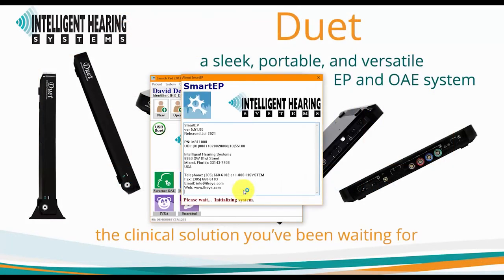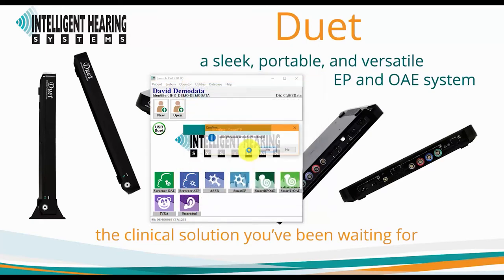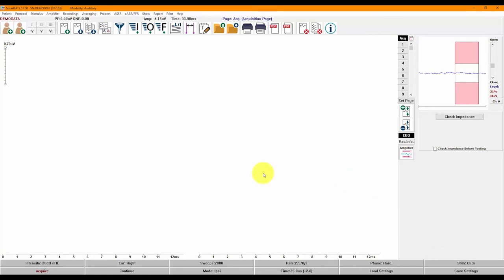Now we will launch the SmartEP software for an overview of its interface. Below the streamlined menus in the user-friendly interface of SmartEP, you will find large accessible buttons on the toolbar that provide easy access to the most commonly used functions. As you hover over each button, a description of its function will be displayed. At the bottom of the screen, you will find a simplified control panel that provides direct main screen access to change any parameter. To quickly begin a test, click on Load Settings and choose from a list of pre-configured test protocols.